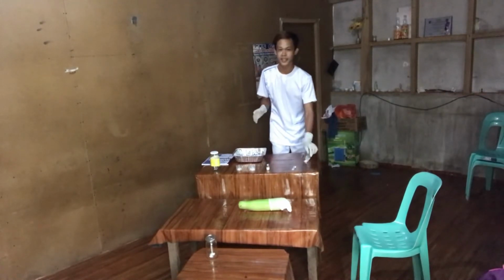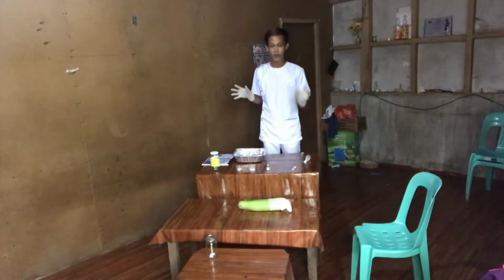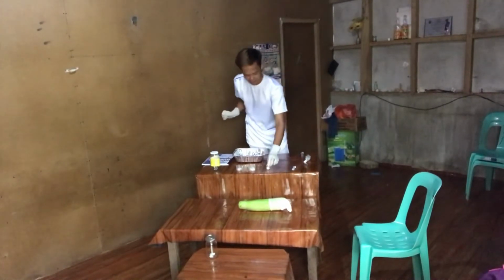Then we're going to set it aside first, and then open the medication vial.